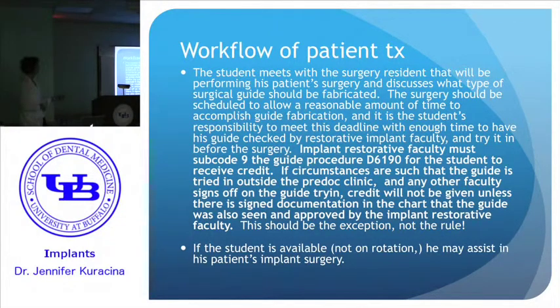Now, this is another issue that we had, which was students having surgical guides signed off, subcode 9, by perio faculty, by surgical residents, by whoever was convenient. And really, we need to be checking that the guides fit. We should be having the students take radiographs to make sure they have things aligned properly. And I know that the timing of things sometimes is such that you can't avoid trying it in conjunction with doing a perio recall, just for the patient's convenience.